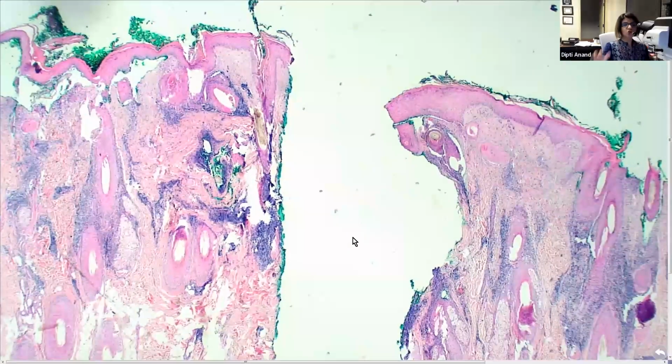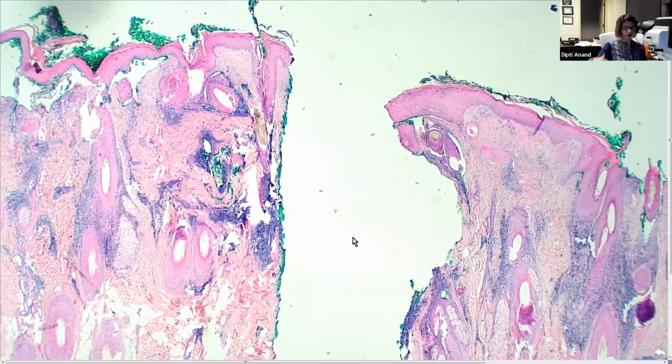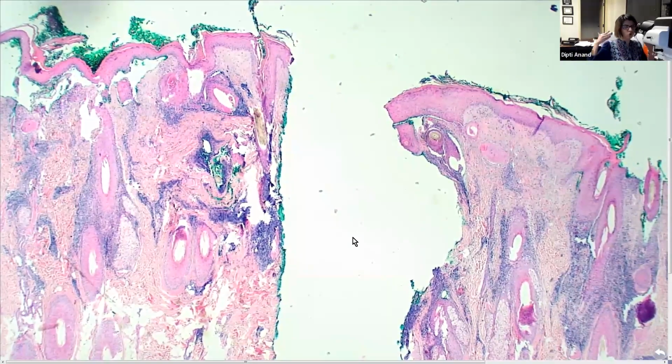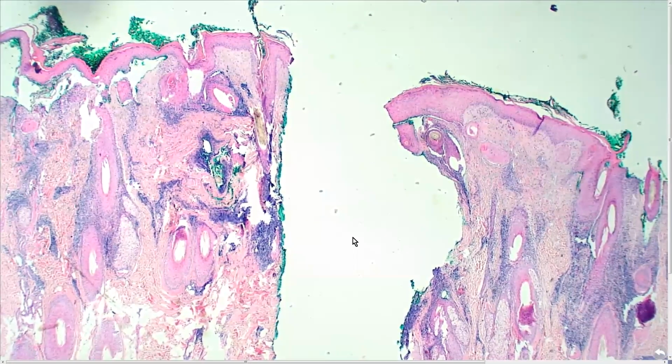So that is why on low power, whenever we see this tight infiltrate, especially on the hair follicles and vessels, superficial and deep, you think about lupus. So you're going into the slide thinking about lupus. And the second thing I do is I look for eosinophils, because if I'm seeing eosinophils, lupus is out of the picture, right? Right. And then I look for the epidermal changes to tie that together. Okay. That was so helpful. Sorry to interrupt. Carry on.